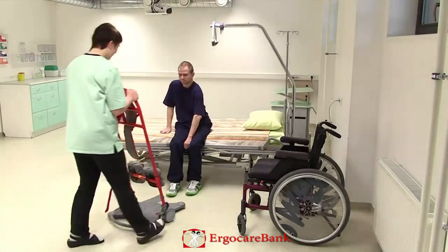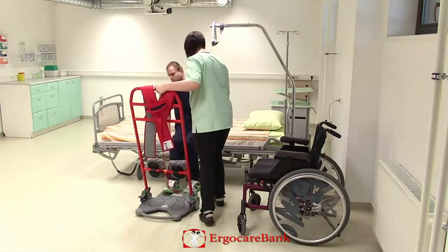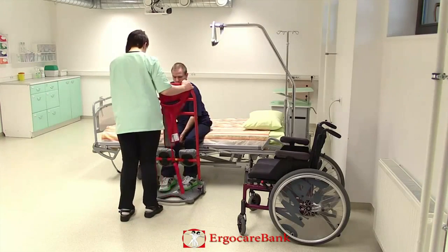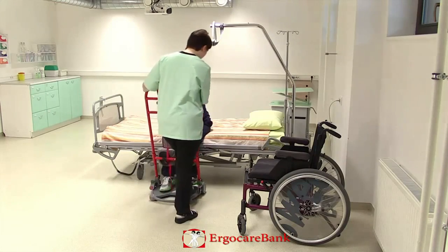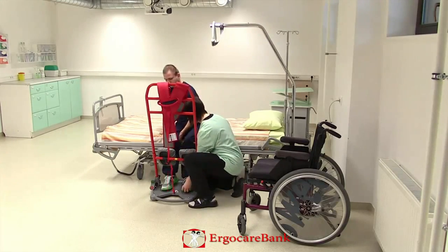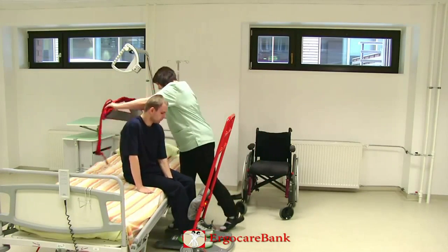Charlie is moving from his bed to the wheelchair. The staff member is using a return to assist Charlie. She drives it in carefully, puts the brakes on, and Charlie puts his feet on the platform. The staff member stands beside him and puts on the belt.